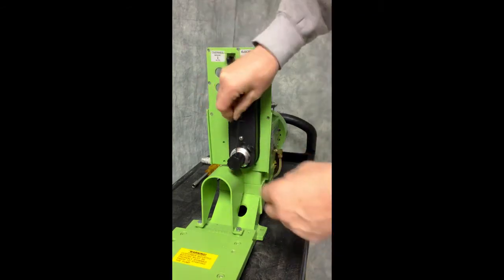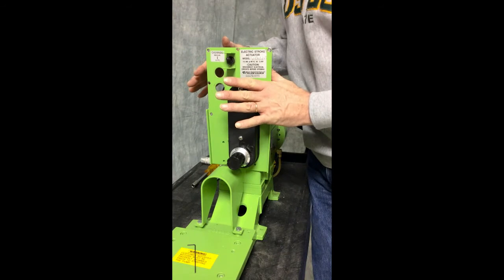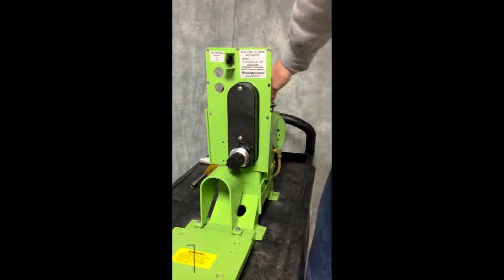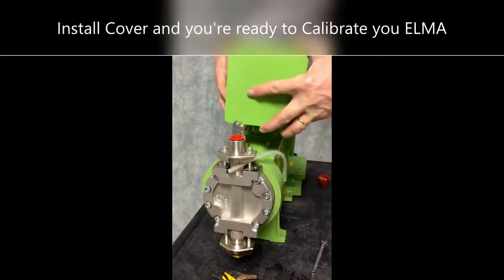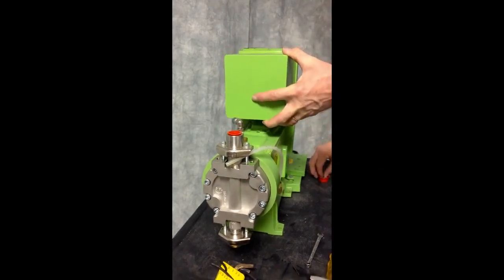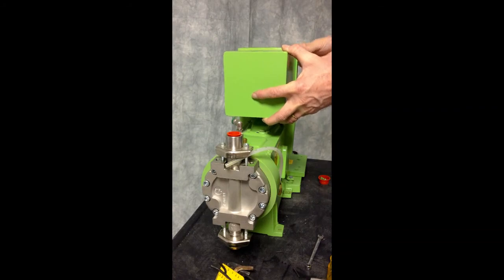You are ready to reinstall power and start running tests. The final thing we will do is replace the cover on the ELMA and tighten down the screws, and we will be ready to go.